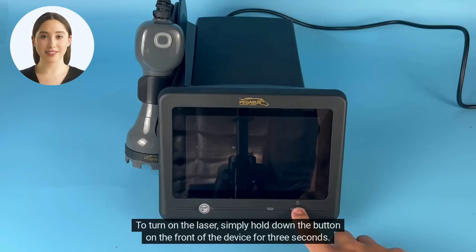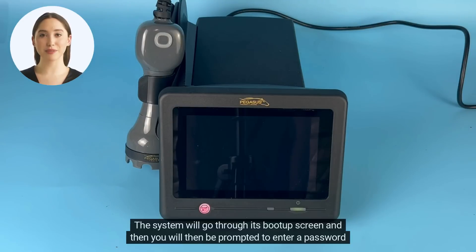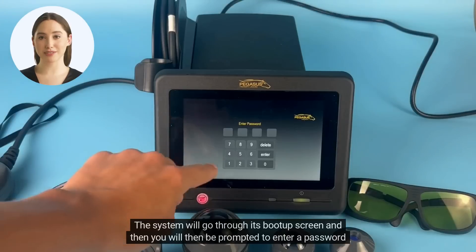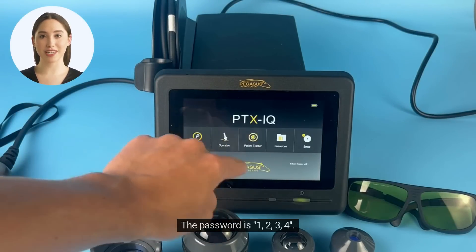To turn on the laser, simply hold down the button on the front of the device for 3 seconds. The system will go through its boot-up screen and then you will be prompted to enter a password to access the system. The password is 1234.